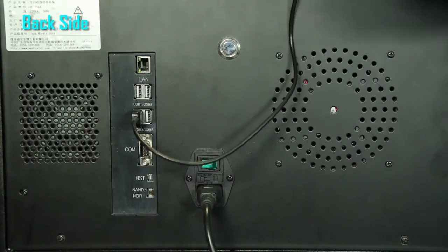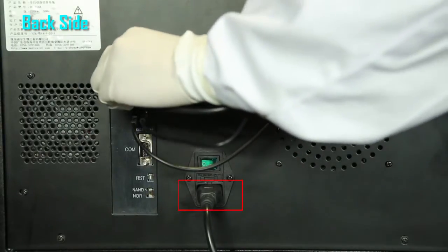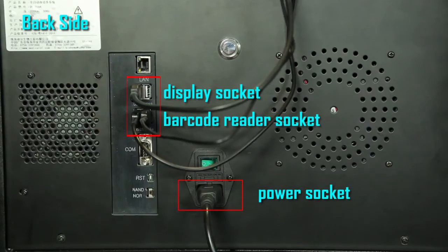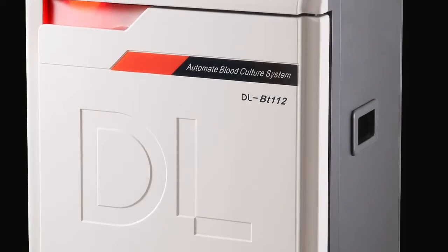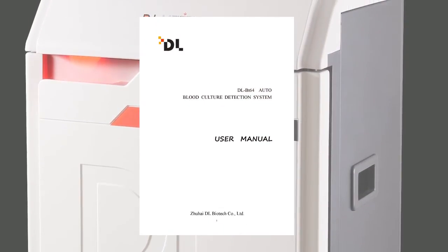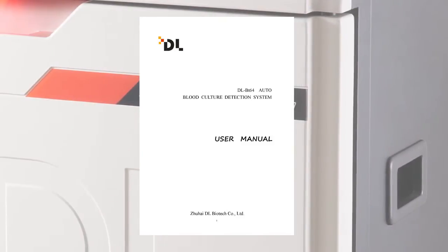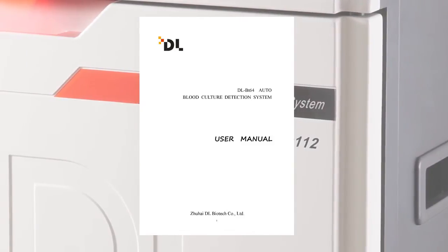There are several connection sockets on the back side of the instrument: power socket, display socket, and barcode reader socket. Before using the instrument, please read the user manual carefully. If you use an inappropriate method, not only will the results be incorrect, but the instrument may also be damaged.